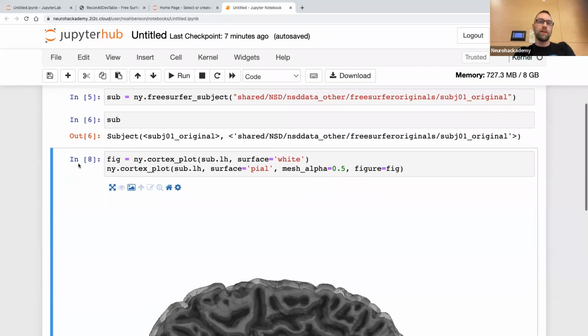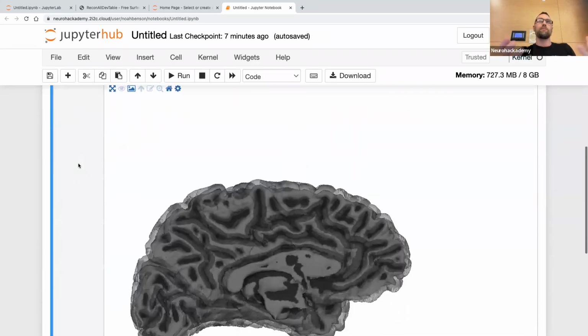Yeah, so that's sort of the second set of things that FreeSurfer does, is come up with these surface representations. The third major set of things that FreeSurfer does is the cortical alignment to the FS average. So that's the animation I showed at the beginning, where it does the diffeomorphic registration of the spheres to the FS average sphere. And so once you've got that, what you have is a set of these exact same vertices that have been inflated to a sphere and then rearranged so that they're in a position that corresponds to the FS average surface.